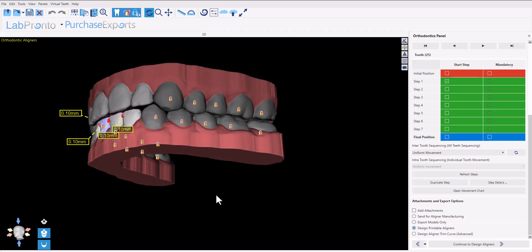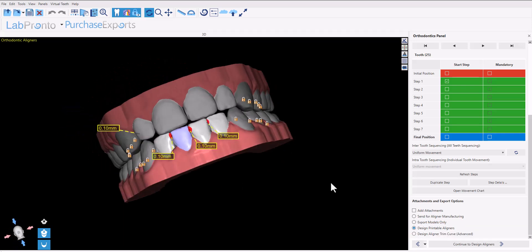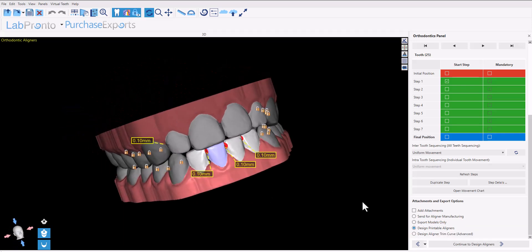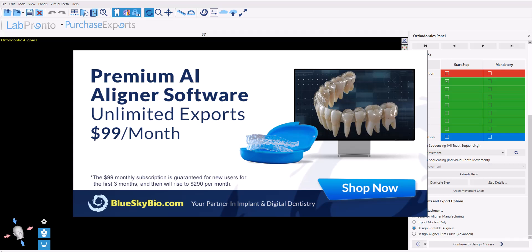It's the same one export credit to export the models and the aligners. We also have an unlimited subscription monthly package - for a low monthly fee you can export as many cases as you like from the Blue Sky Plan software.